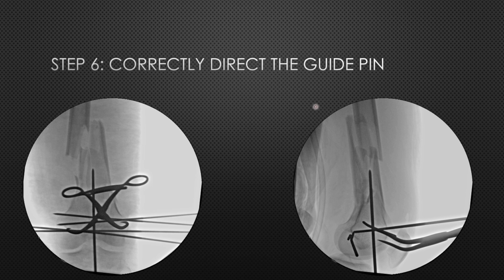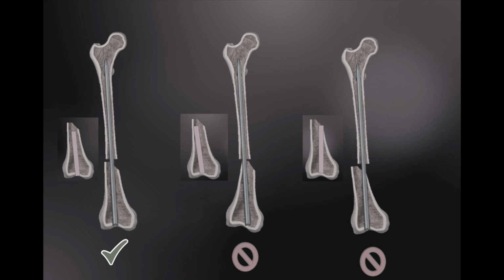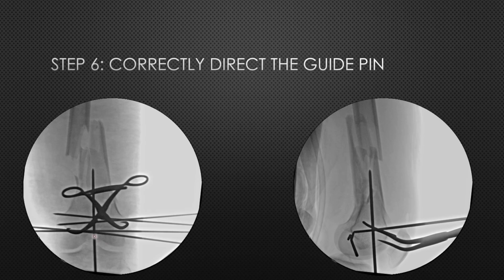Now guide pin insertion direction has to be correct, because ultimately what you are going to do, you are actually going to create a small track in this zone that will guide the nail insertion. So if you have not made this entry perfectly central and perfectly in line with the canal, ultimately the fracture may tend to displace according to the direction of wrong track being created. So the guide wire has to follow the path of the intramedullary canal. So here that has been done.